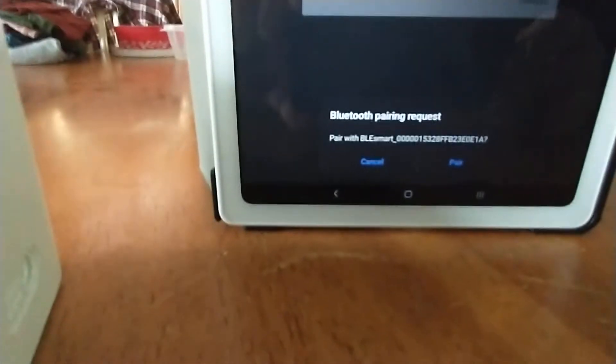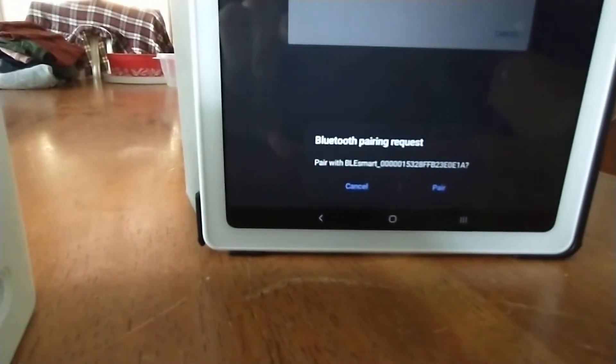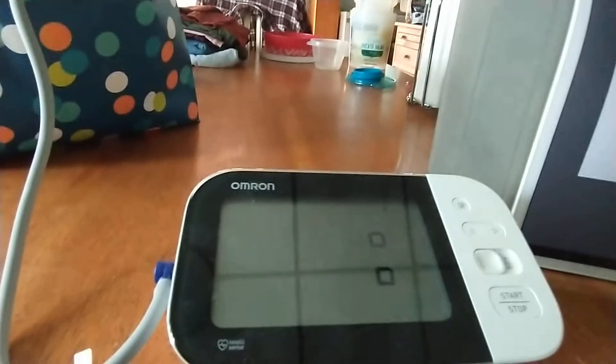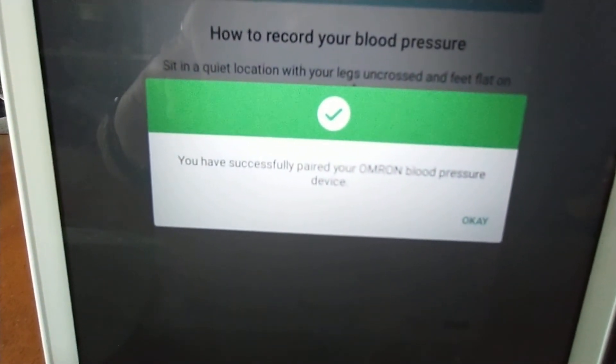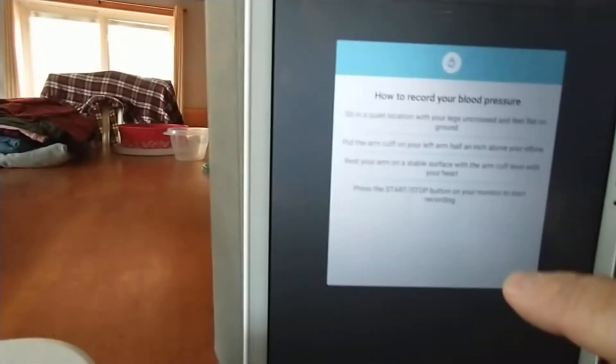Now if you look at the bottom of the screen, it says 'Bluetooth Pairing Request.' This is the phone — the phone is now trying to pair, so you hit Pair. And then we're now getting some additional symbols on the monitor and it says OK. On the app it says 'You have successfully paired your Omron blood pressure device.' Press OK and we're done.